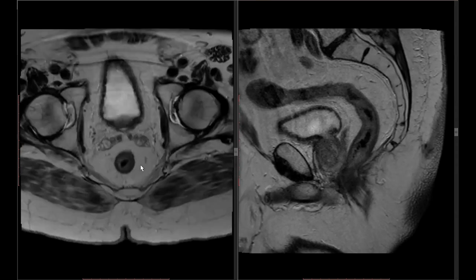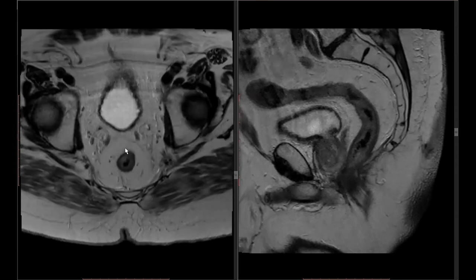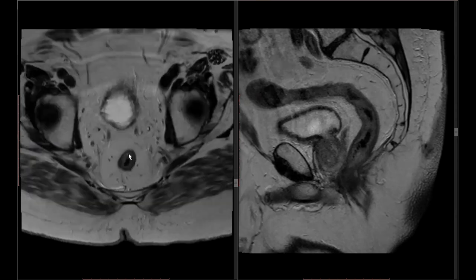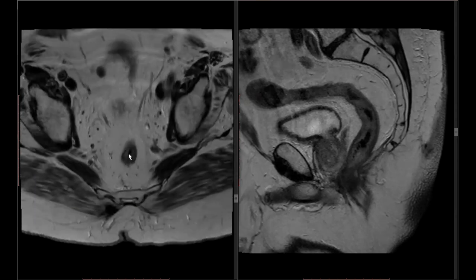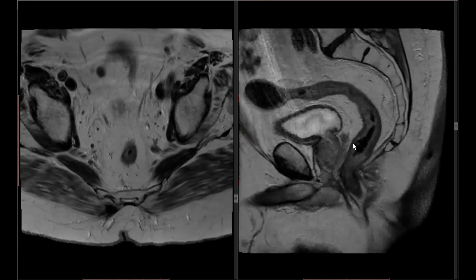The peritoneal insertion is an important structure to identify because tumor can spread into the peritoneum. While not a very likely event, you need to pay close attention to it as it affects staging. Also in terms of T-staging, the peritoneal insertion can lead to slight changes in how you stage and what you put in the report. So the peritoneal insertion is another key anatomic structure to identify, alongside the extent of the rectum, the rectal wall, and the mesorectal fascia.